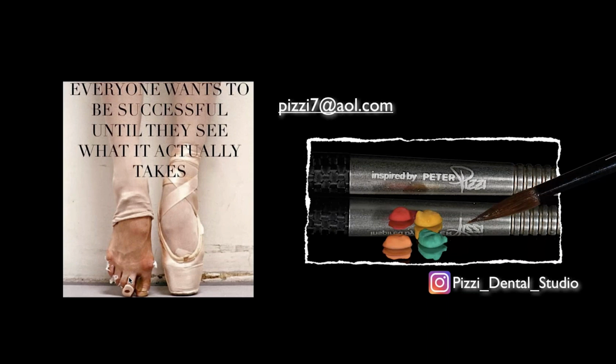There's probably a few people who are better at it than I am at this point, but it's a challenge, right? Because you have a 20 percent shrinkage factor, and because you're working in what feels like chalk, it's very difficult to create smoother surfaces. It's kind of like either a sharp angle or no angle. So I'm really just using very slow speeds, different burs, even using a Barker knife here and there, and really just trying to develop as much as I can.